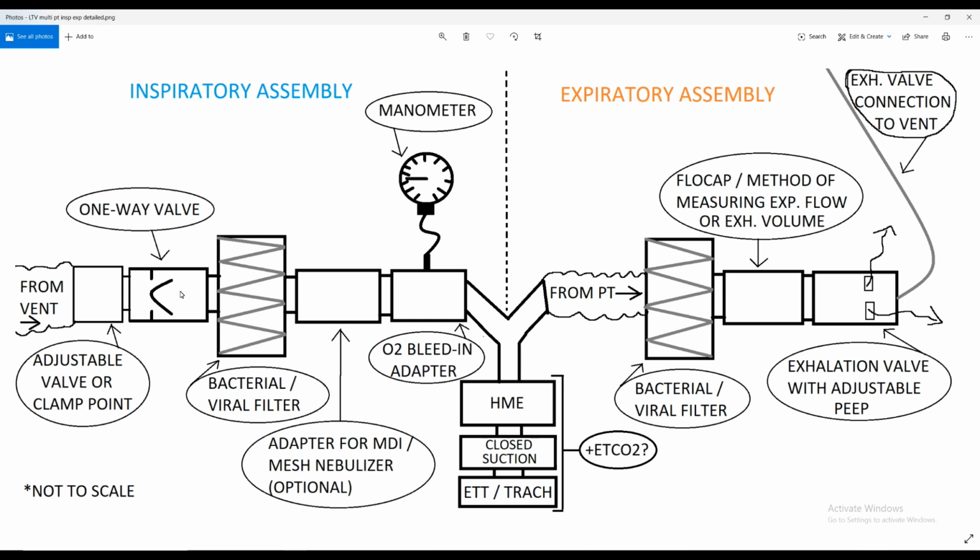Or it could just simply be a clamp point, like if you have those big, thick rubber adapters. The only thing I could think of that I ever actually used them on was some expiratory part of an old 7200. But those big, thick, rubbery adapters, if you adapted in one of those right here and just had it be a clamp point, the whole idea is that we can use this to adjust the actual pressure that the patient is getting versus relying on the pressure that's coming from the ventilator.